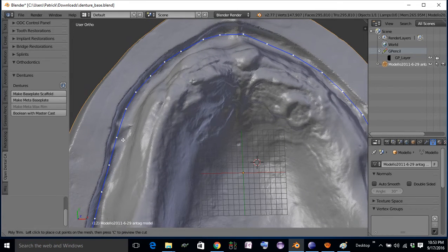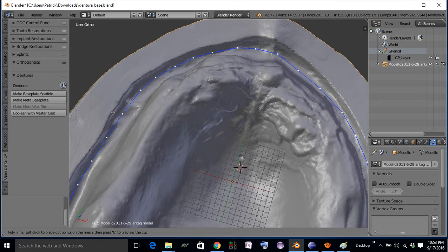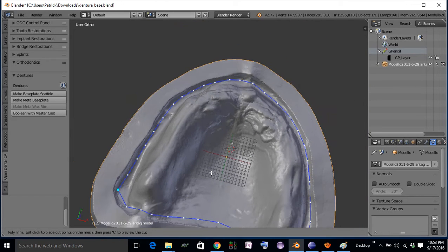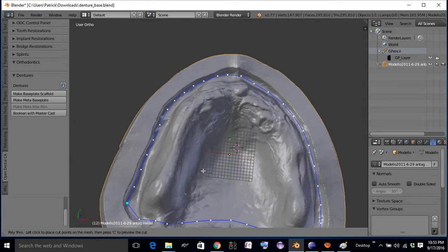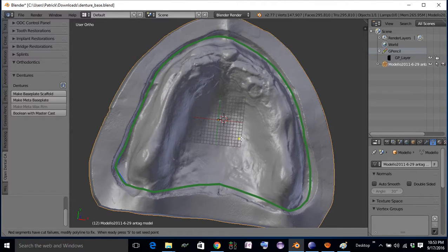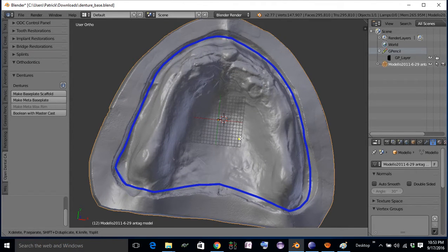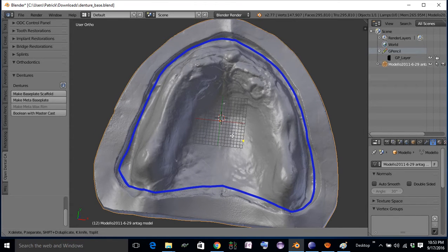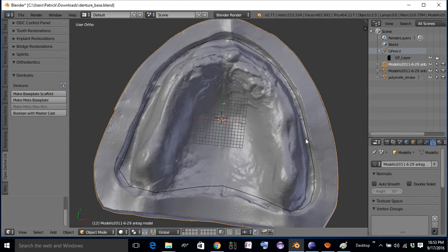You want to go past the depth of the vestibule, but not all the way up to the land. So we'll press C to preview our cut, S to select a seed, D to calculate the cut, and then Shift-D to duplicate that area out.